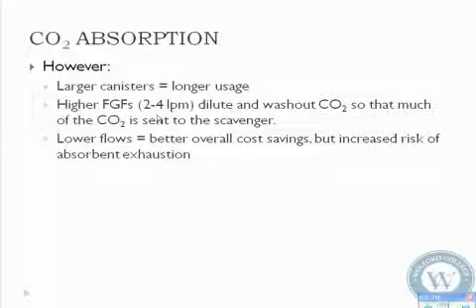We've already talked about the high fresh gas flows, and you'll see a lot talking about low flows. People use low flows everywhere, all over the country, because it does save a lot of money in terms of the amount of volatile agent that's used. But we're going to teach you here that you don't use low flows in short cases. We use high flows in short cases. We're talking cases that are greater than 30 minutes here. That's when you're worried about your CO2. Okay?